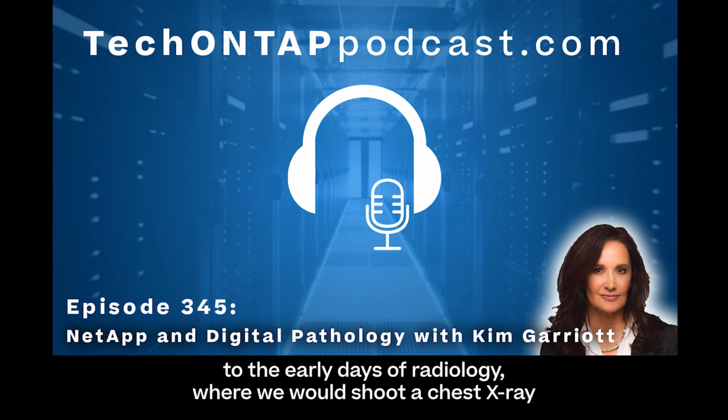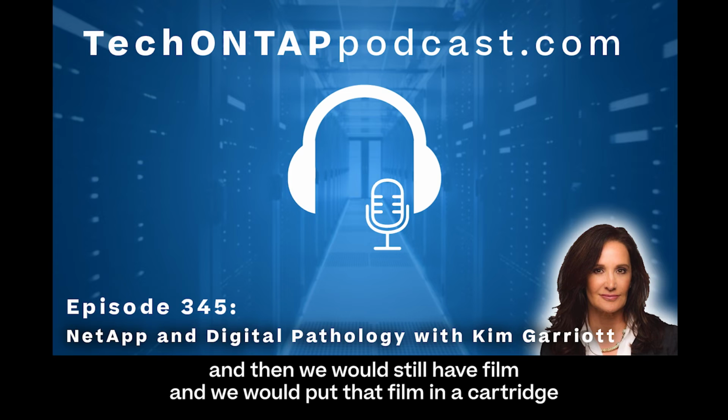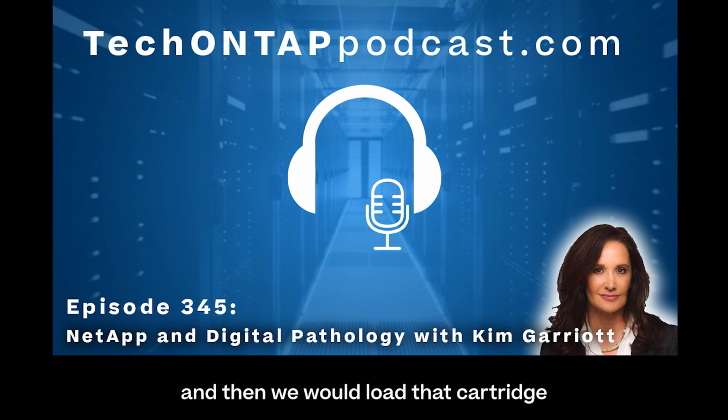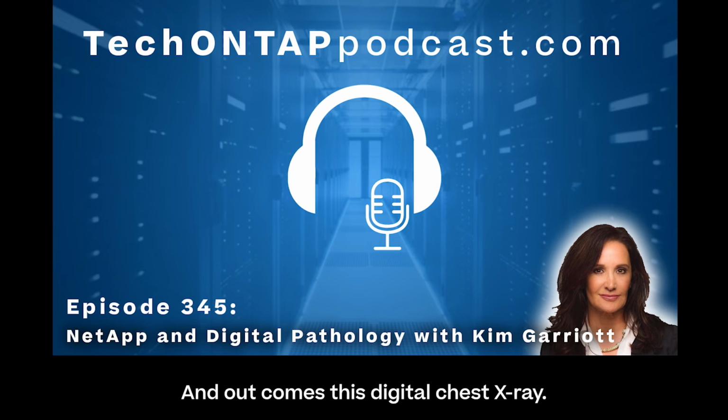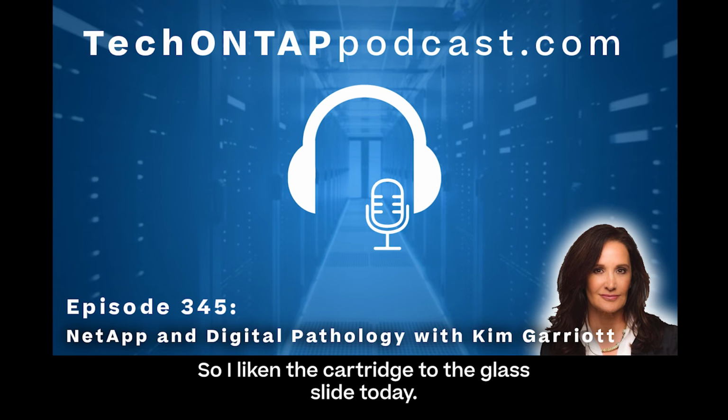This is very similar to the early days of radiology, where we would shoot a chest x-ray and still have film, and we would put that film in a cartridge, and then load that cartridge into a digitizer, and it would be digitally scanned, and out comes this digital chest x-ray. So I liken the cartridge to the glass slide today.